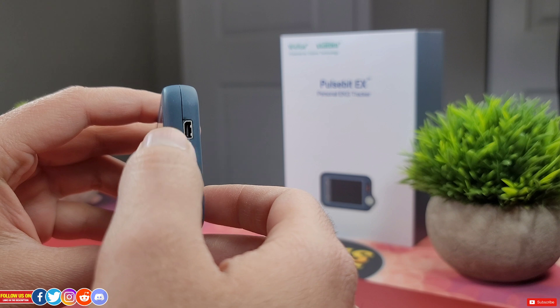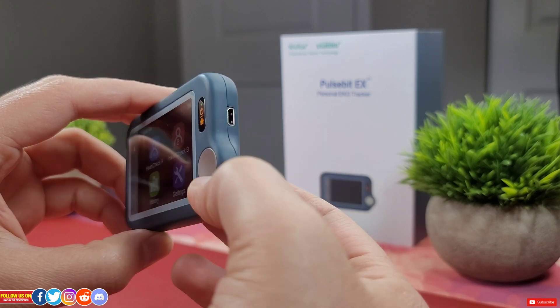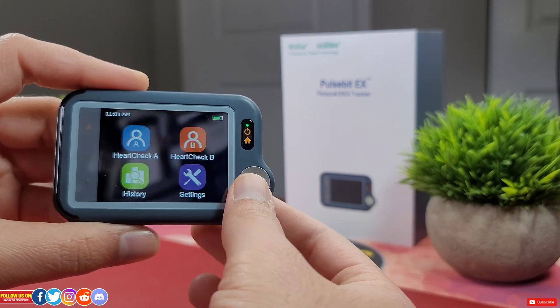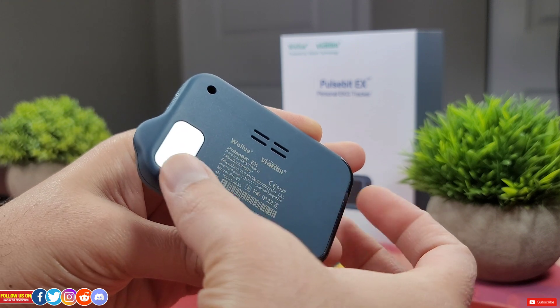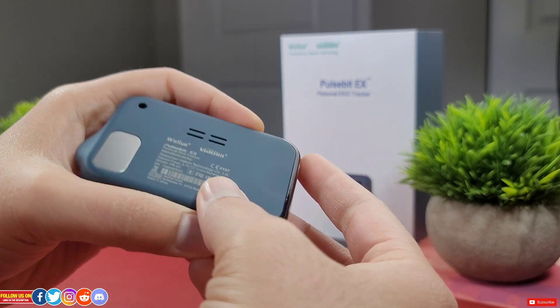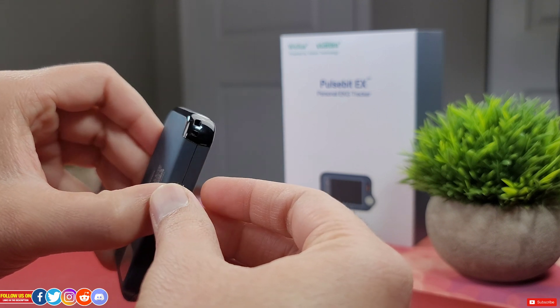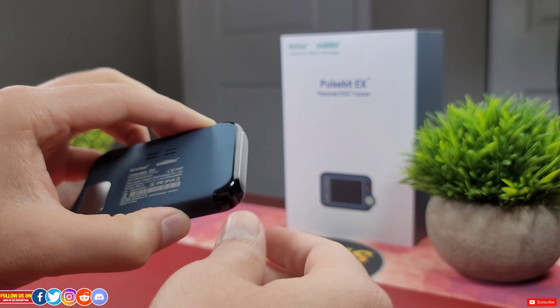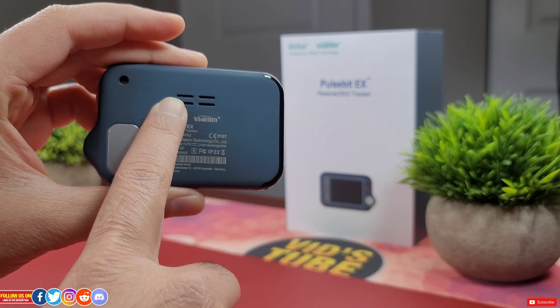If you notice, the silver metallic pads are the electrodes. On the front there is a round electrode, at the back there is a rectangular electrode, and there is a stripe electrode on the side. There is a neck strap attachment in case you need to carry this device. At the back there is regulatory information, and there is a built-in speaker which beeps when you take a reading.